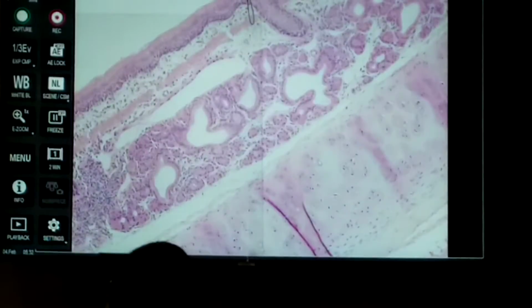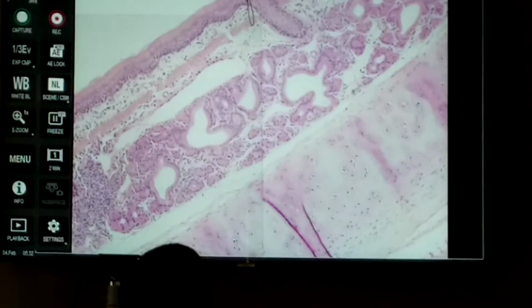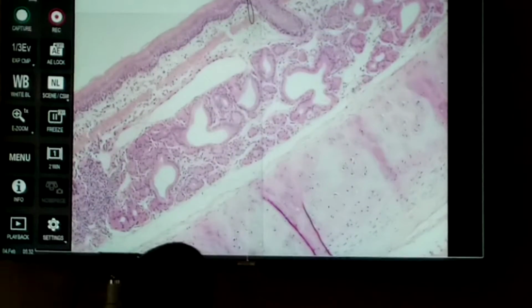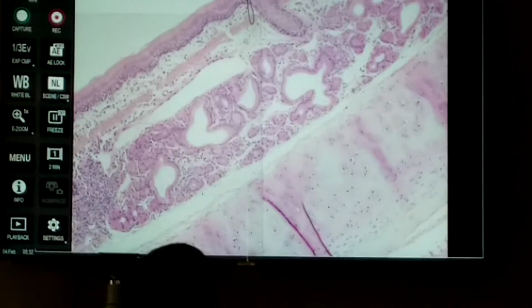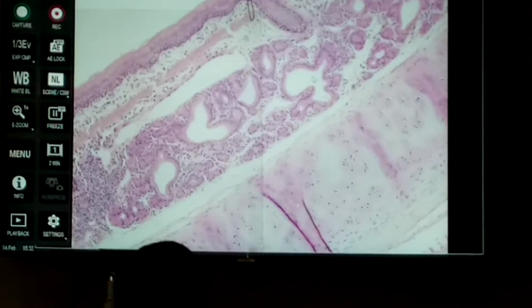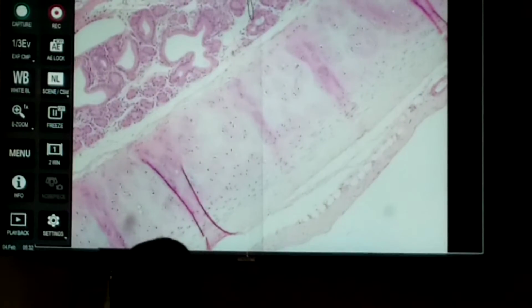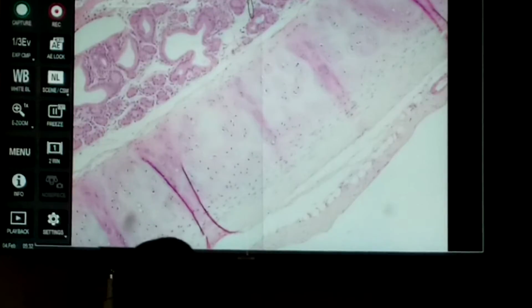And they're going to empty through a duct to the surface, and that's the duct that shoots them up to the surface. You don't see the lumen in it. Well, here's a kind of a longitudinal cut that reaches down to these glands. And of course, the wall of the trachea is supported by cartilage, and that's what we see right here. This is hyaline cartilage.